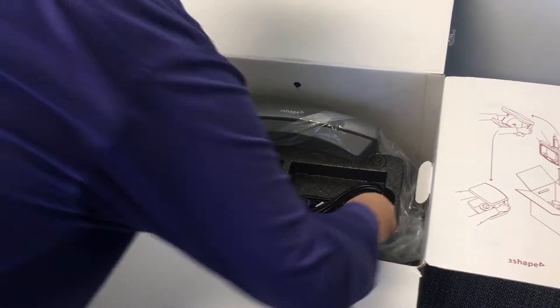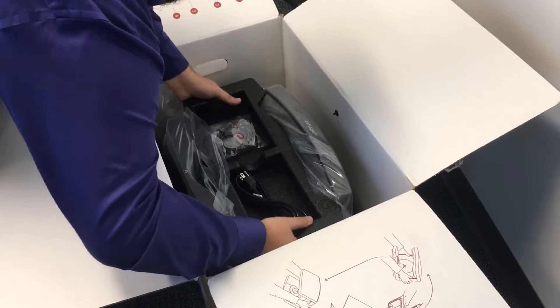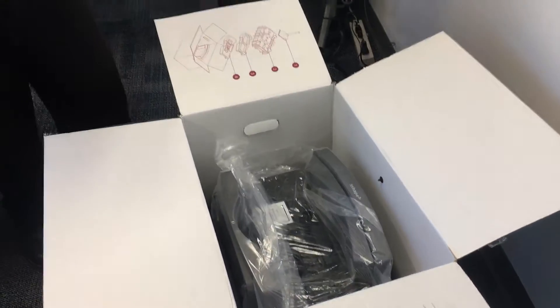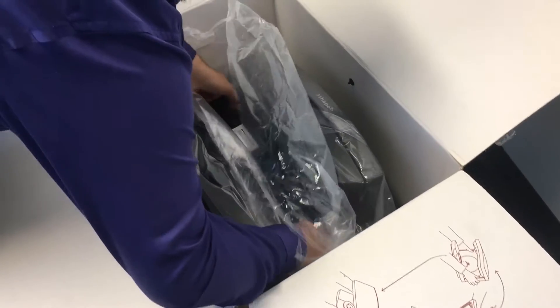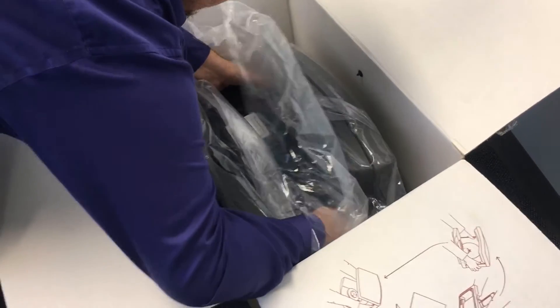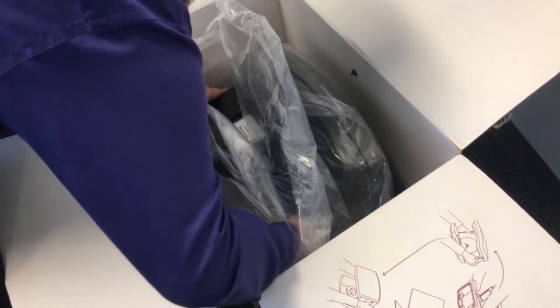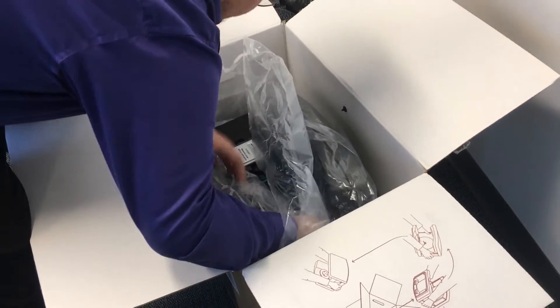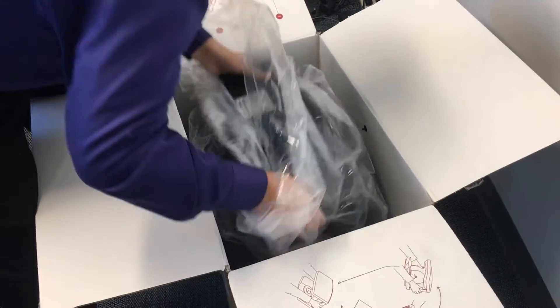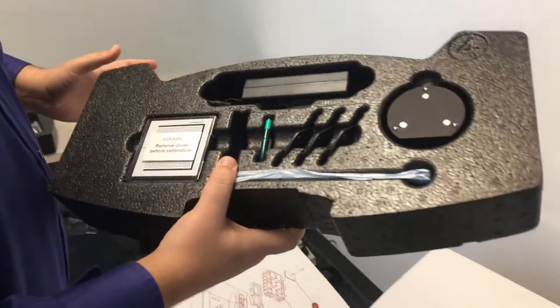It looks like the way they've packaged it is everything kind of fits inside the scanner. Right off the bat, we're looking at some of our cables. We're going to pull these out, being careful not to hurt our scanner in any way. There's more in here, so we're going to open the plastic and pull this out. It looks like this scanner does not come with a calibration kit — instead, it comes with everything in these foam containers, and they're in there very snugly.